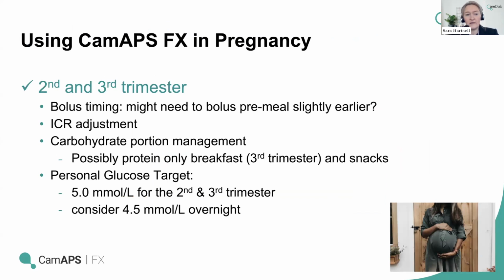Looking forward to the second and third trimester, bolus timing might need to be slightly earlier, but really be led by what you're seeing, looking at the data that Candice was showing you in terms of what happens to the glucose and the algorithm insulin delivery following a meal. We certainly don't generally find the need to really increase the timing vastly.